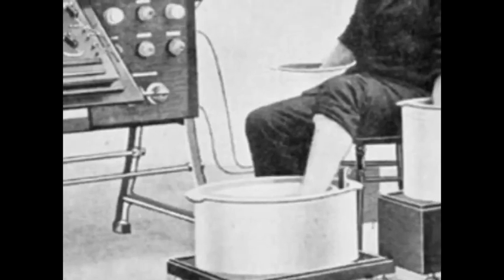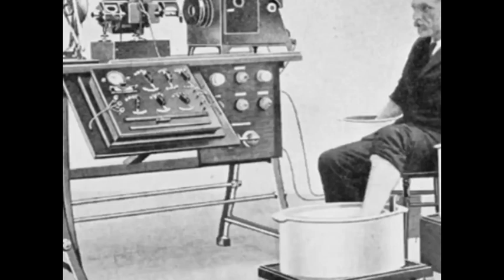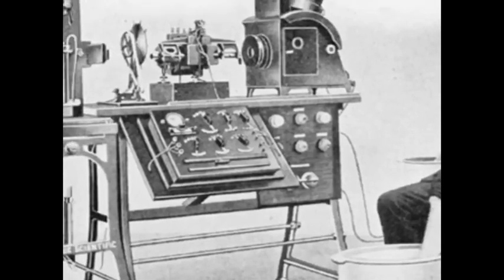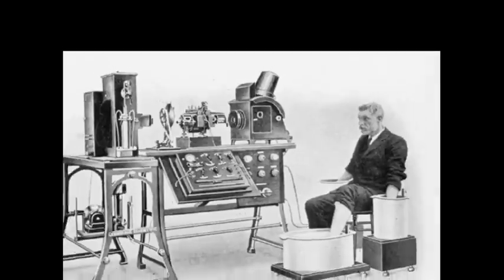This big container contains salt solution and works as the electrode. One foot and two hands are immersed in this. This is to know the history of how the ECG was invented and how bulky the machine was at that time.